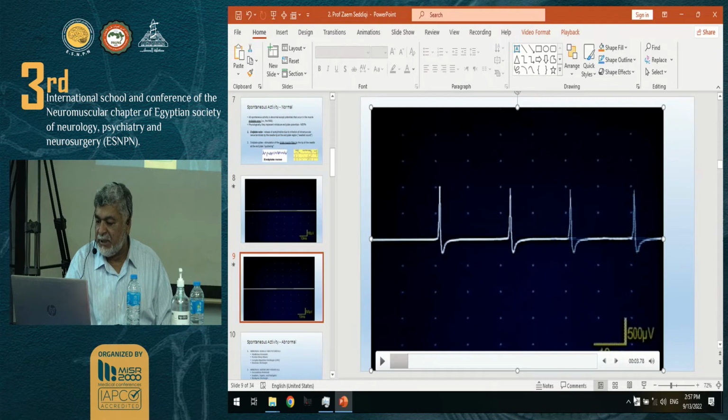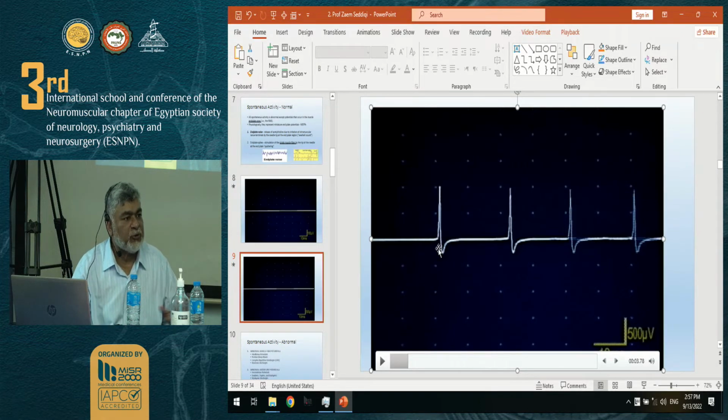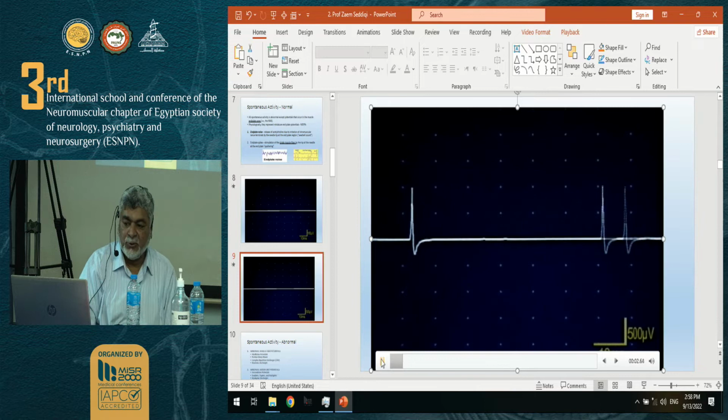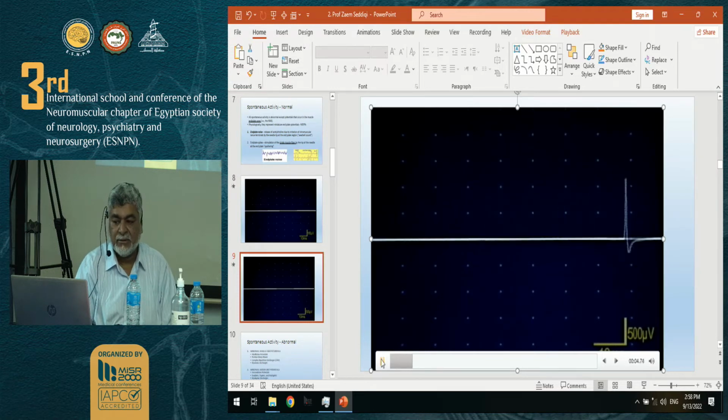I can check the gain here. You can see from here to here it's 10 milliseconds, but the potential is barely 1 to 3 milliseconds. This can't be a motor unit, and it can't be a fasciculation. It is a very short duration sputtering sound, like putting water in oil, have you seen it? This is what the sound is. Okay, here we go again. Very irregular.